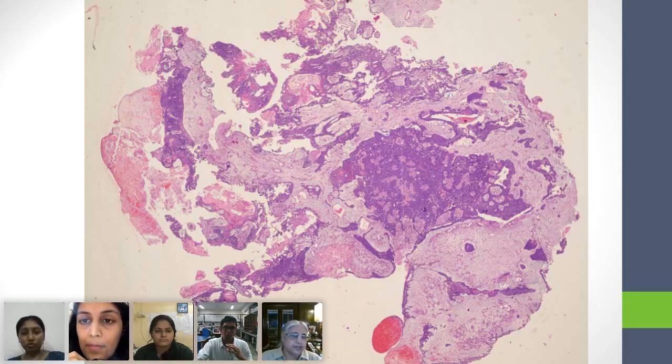No, what I see is, I can imagine that this thing is a piece of tissue that has been punched out from this oroantral fistula, and you see that there is a surface to this thing. See, there is a surface at the bottom over here, and there is a raggedness at one end. So this thing has protruded, so there is a surface.